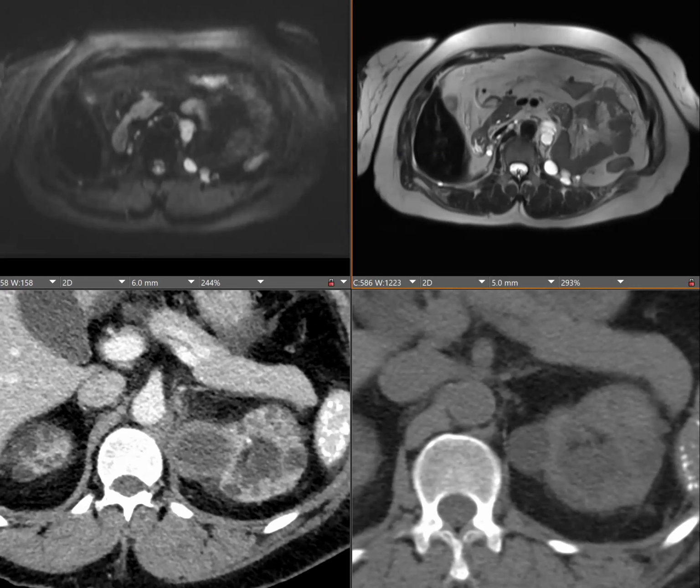So that was this case. I think it'd be great for a case report. Go ahead. I'm skimming this AJR article, and it is very interesting. This clear cell papillary variant, I can put it in the chat, but basically, it's frequently seen in patients that have renal failure. So it sounds like this patient who had the cystic disease of dialysis. And it's about 50-50 cystic and solid. And they do say the cystic ones are generally indolent, just like other cystic renal neoplasms. So this is a super interesting presentation of mets. But the fact that they were growing over time, that's really weird.